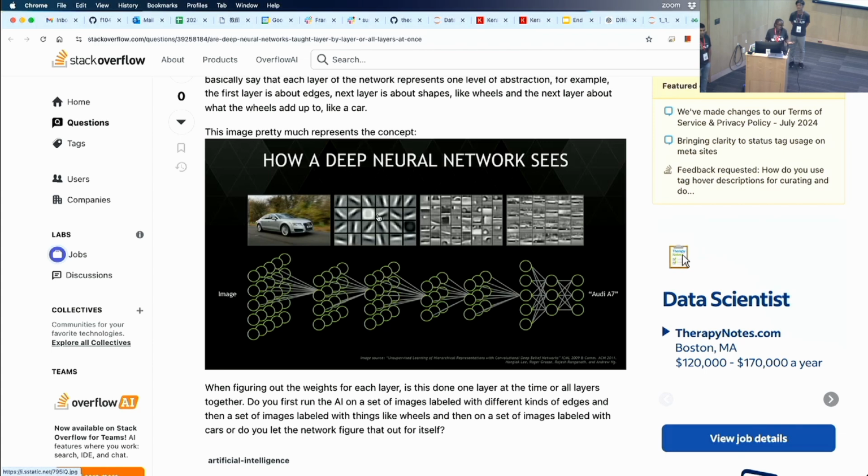So these are okay for medical imaging. Now, this specificity here for wheels may not be very relevant for medical imaging, right? So then you want to drop those layers because you want those more advanced layers to learn what's the edge of a lung or what's something else, right?